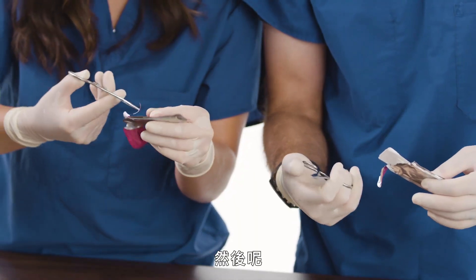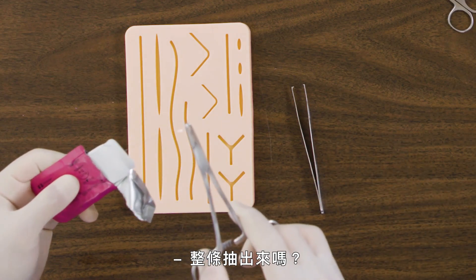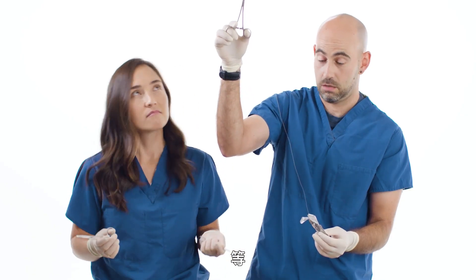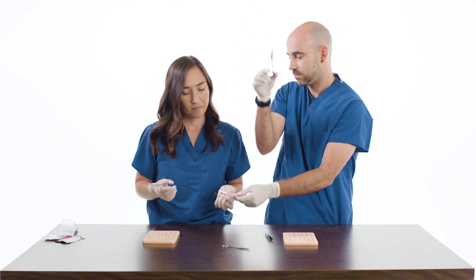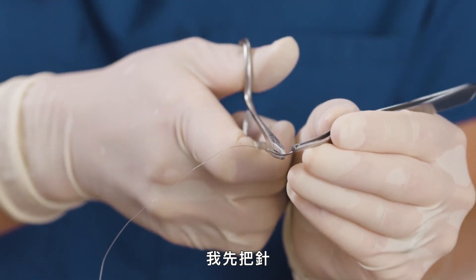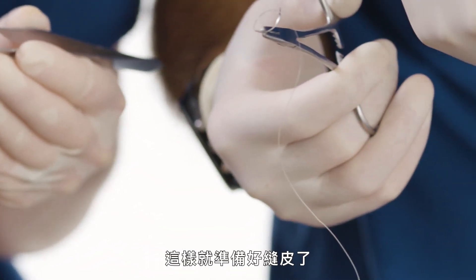The needle is in there, so be careful. Oh, you put your thumb in the hole — just for that part. Oh, hypocrisy. Take the whole thing out. The way to properly hold the needle — use your pickups to help you. I'm going to hold my needle halfway back at a 45-degree angle at the very tips of my needle driver. So now we're ready to close skin.